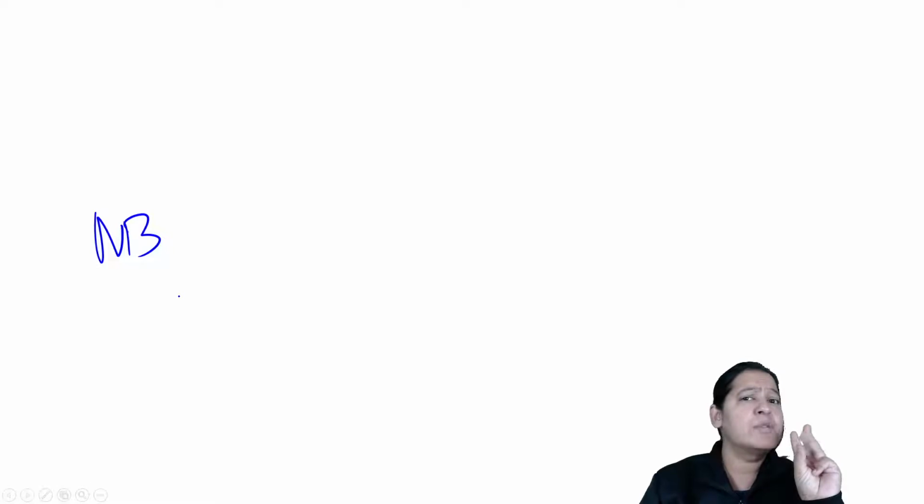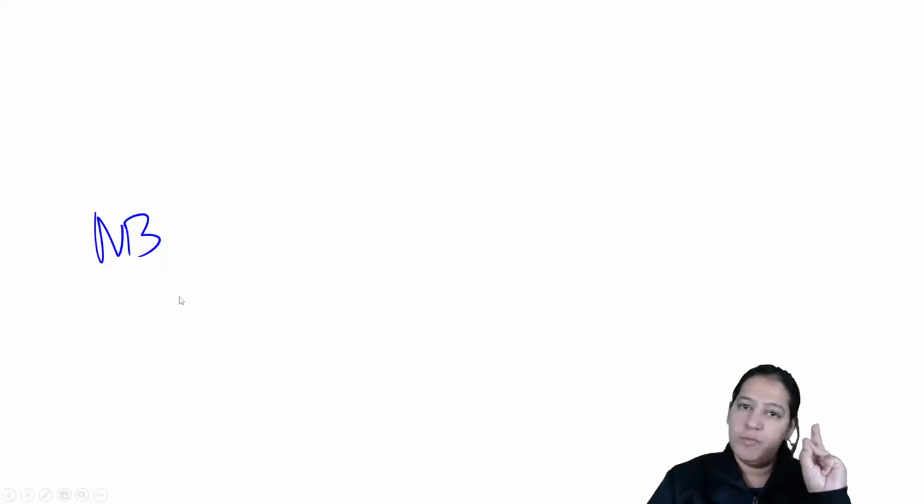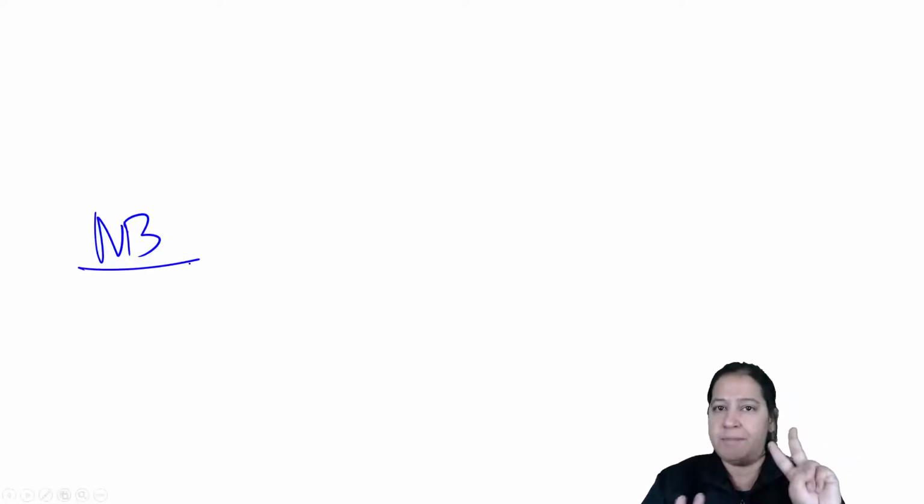इसके अलावा तीसरा यूज है स्पर्म काउंट, जो तुम्हारे सिलेबस में नहीं है, बट यू शुड नो स्पर्म काउंट, ह्यूमन मेल सीमन में स्पर्म काउंट के लिए, सो वेदर द ओलिगोस्पर्मिया इज देयर और एजोस्पर्मिया इज देयर और नॉट देयर. So we can use the Neubauer's chamber, but the procedure is not in your syllabus. So only RBC count and WBC count in blood, we are using Neubauer's chamber for MBBS syllabus. But there is a third use also, you should know it.